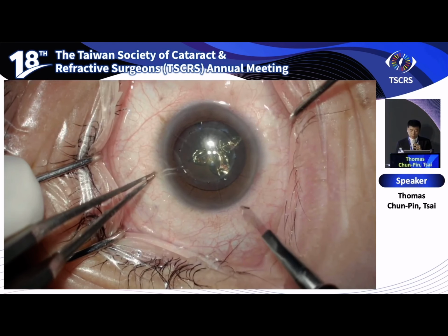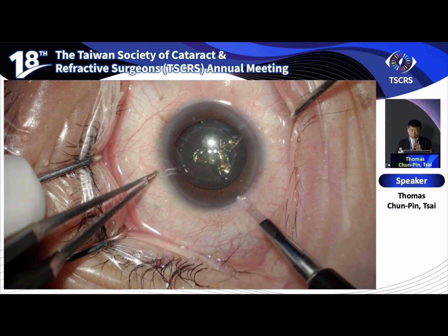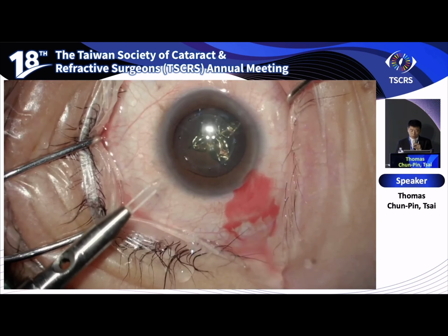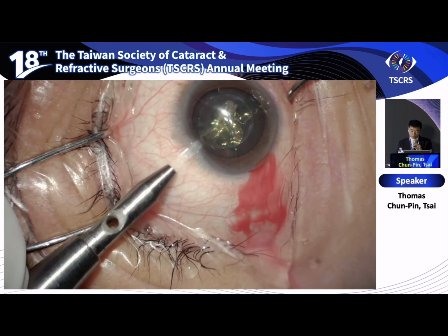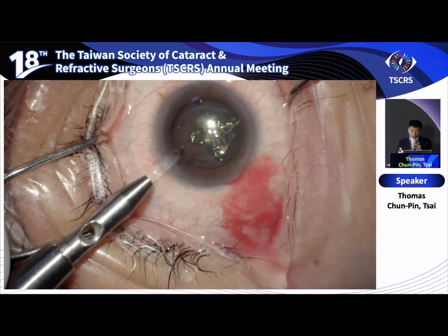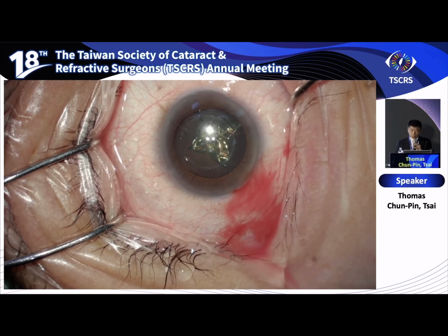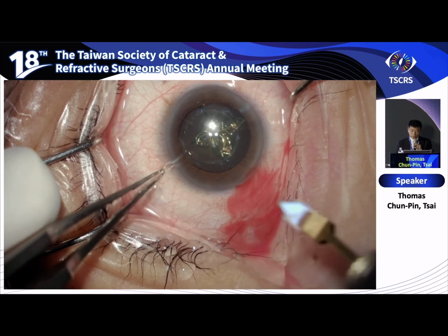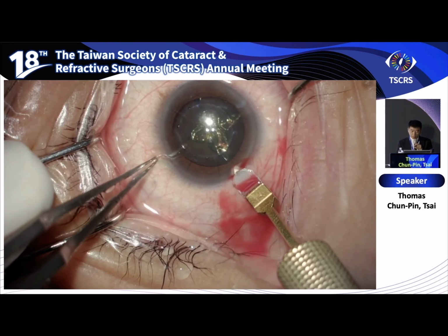This is the cataract operation video of this patient. He wants to use femtosecond laser for his cataract surgery. I don't use femtosecond laser to make the corneal incision in RK eyes, because I need to choose the right place to avoid wound leakage. We should keep in mind that nearly 80 to 90% of the cornea thickness was cut during the RK surgery. Don't ever cross the RK cut incision. That will make a disaster.